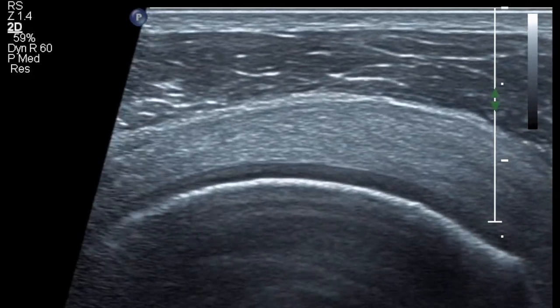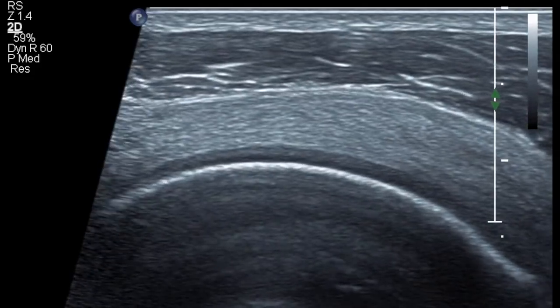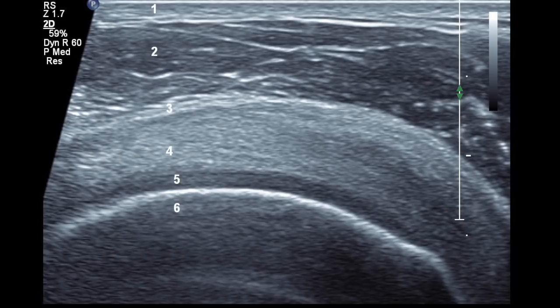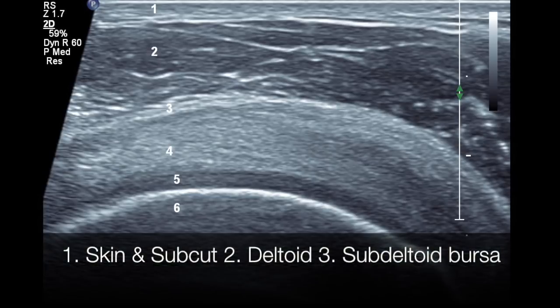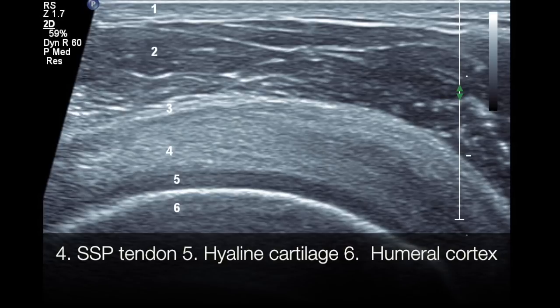The same has to be assessed also in a transverse view. You can see the nice depiction of all the six layers that you need to see, and they are namely: the skin and subcutaneous tissues, the deltoid muscle, the sub-deltoid bursa, the supraspinatus tendon, the hypoechoic hyaline cartilage, and the humeral cortex.